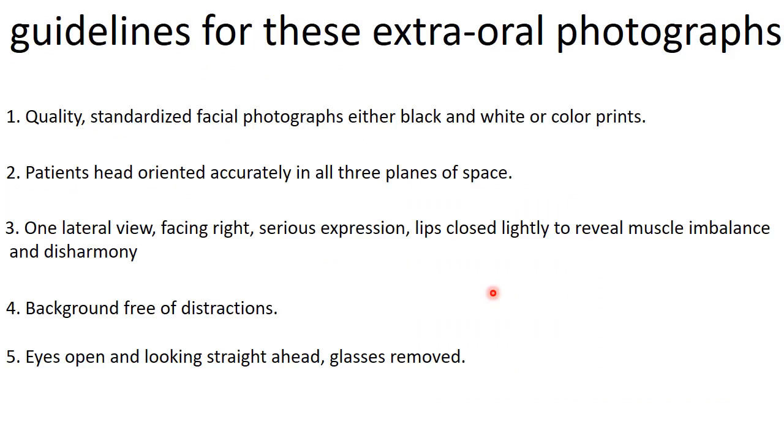So what are the guidelines for these extraoral photographs? First is quality. The standardized facial photographs are either black and white, which was in the past, or color prints. The patient's head should be oriented accurately in all 3 planes of space. One lateral view facing to the right with a serious expression.